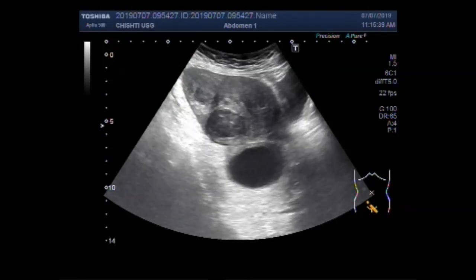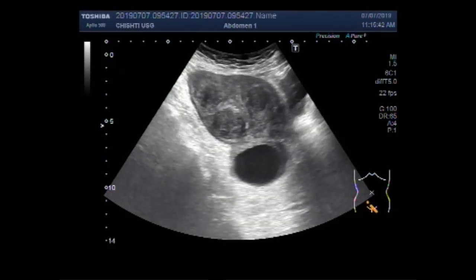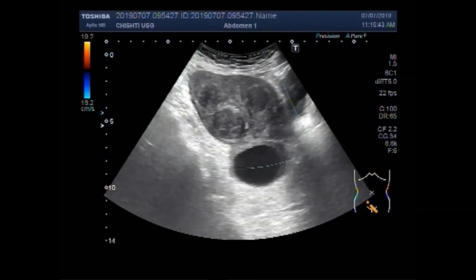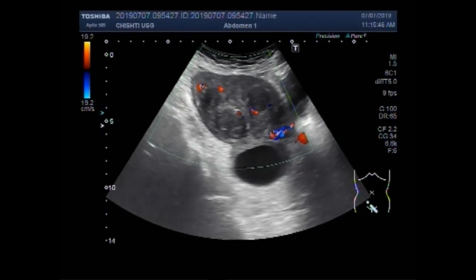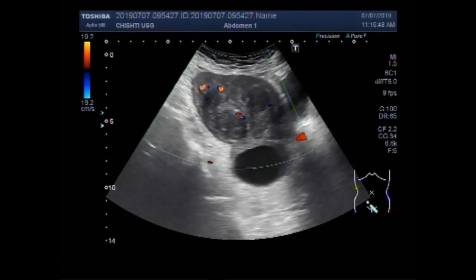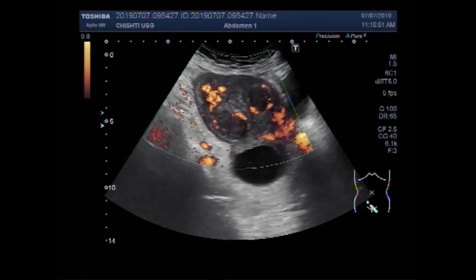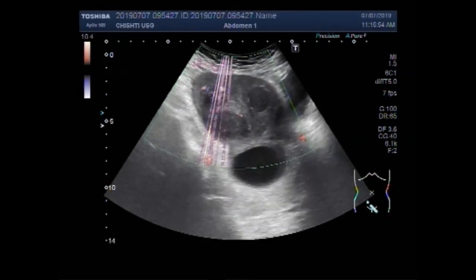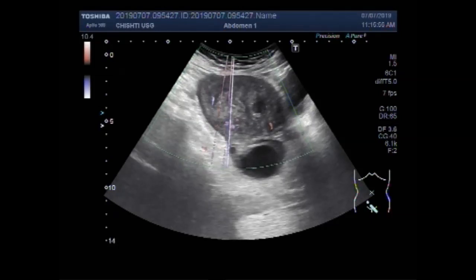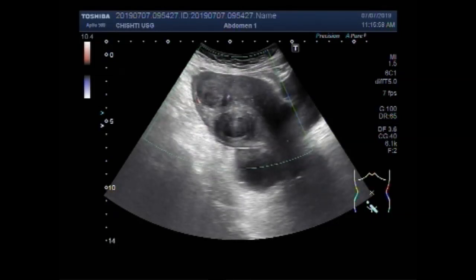These masses are semi-solid to solid in consistency, round to oval in shape, and have heterogeneous echogenicity. A fair amount of blood flow is also seen in their interior. You can see the blood flow.